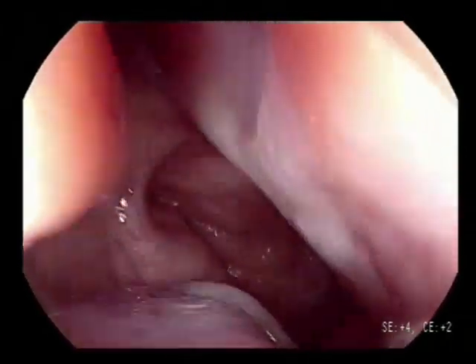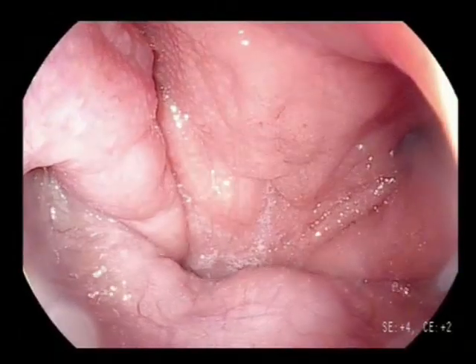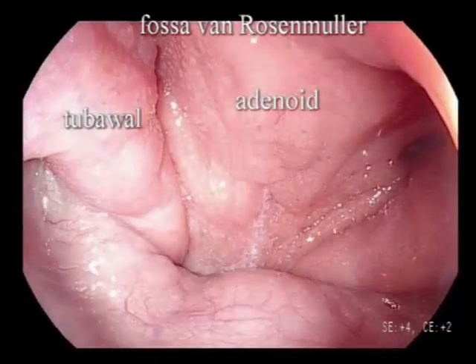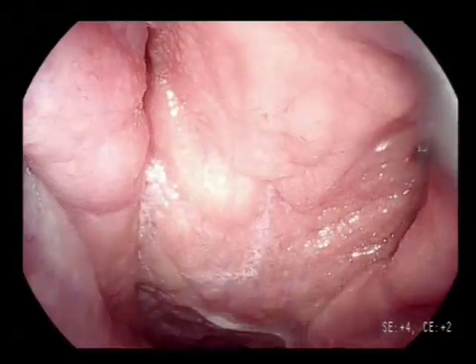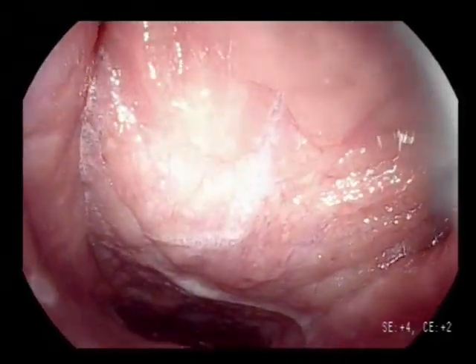When entering the nasopharynx, you can test the palatum by letting the patient make an S sound. By letting the patient breathe through the nose, the palatum can also be assessed.